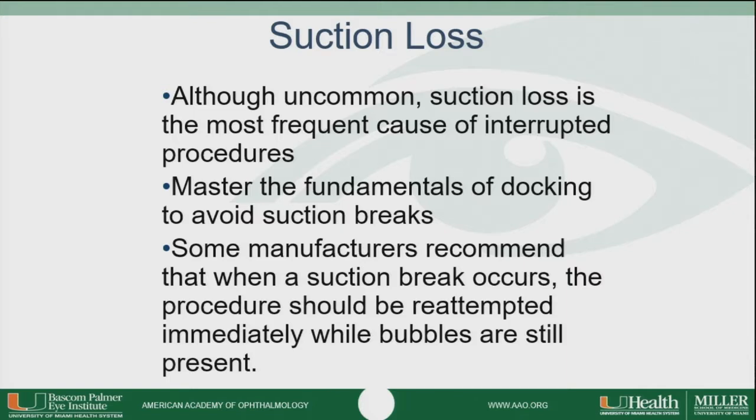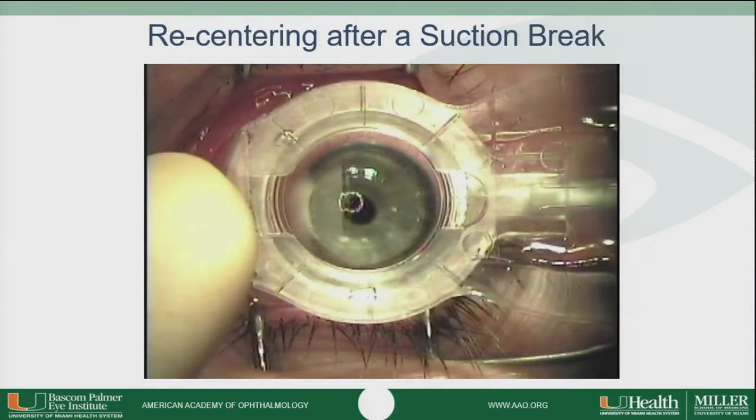Mastering the fundamentals of docking is important to avoid suction breaks. Make sure that you have complete suction and not pseudosuction. And some manufacturers of the femtosecond lasers recommend that when a suction break occurs, the procedure should be reattempted immediately while the bubbles in the interface are still present.